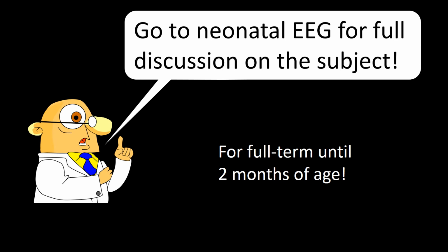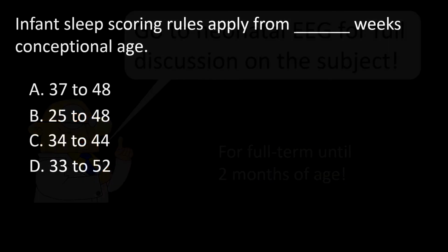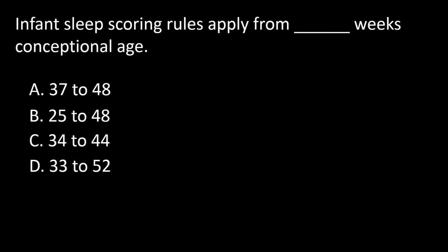The manual recommends that this montage and monitoring, as well as the rules, be used for full term infants until 2 months of age. For further discussion, you can see and hear the YouTube video entitled Neonatal EEG. So the answer to this question is A.